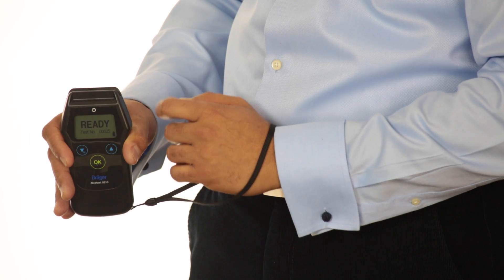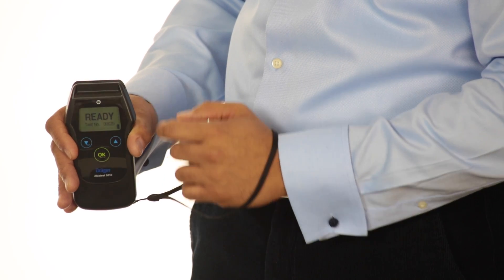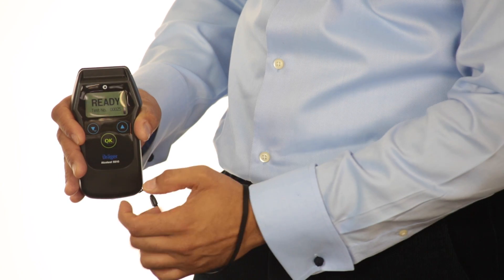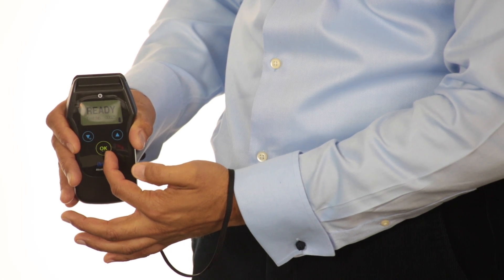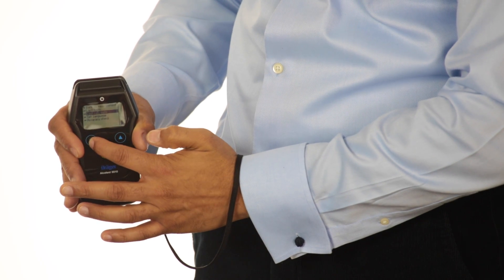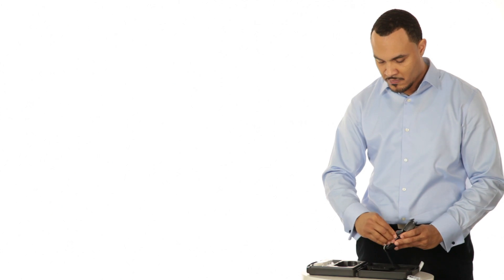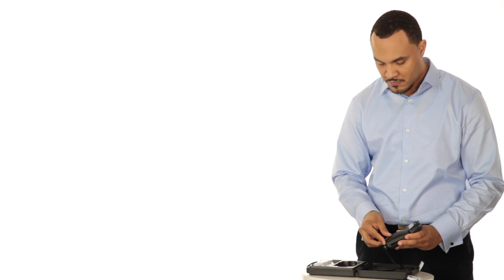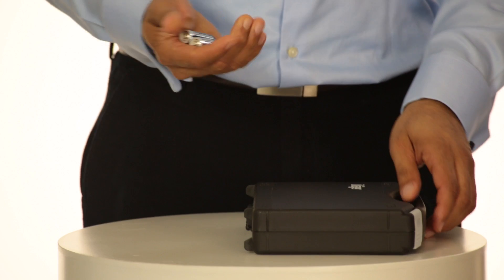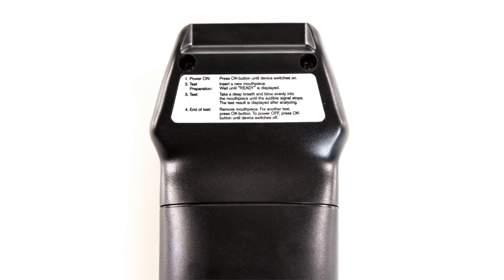The back-lit LCD screen displays results in large, clear text that is easy to see both during the day and at night. Red and green LED lights and sound indicators support the display readings. The menu arrow and OK buttons make it easy to navigate through a variety of settings and functions. The battery compartment holds two AA batteries capable of powering the device for more than 1,500 tests. The Alkotest 5510 comes with a handy carrying case that includes two AA batteries, three mouthpieces, a wrist strap, and four quick operation labels.